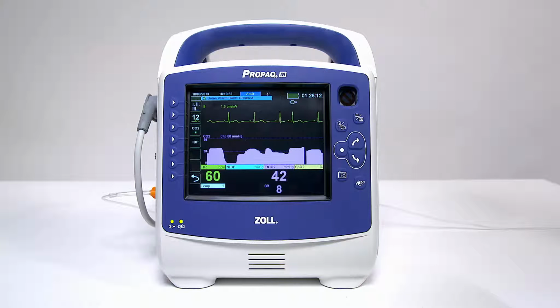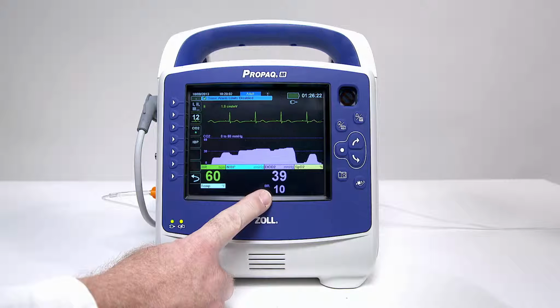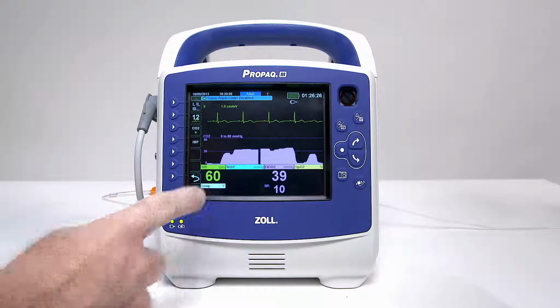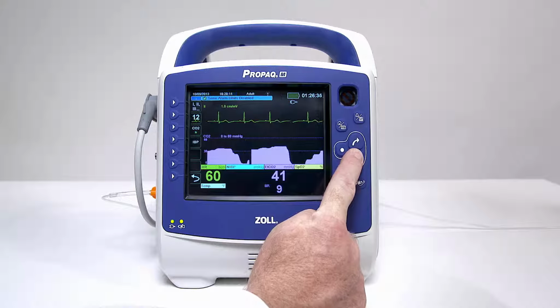The CO2 display gives the current EtCO2 value, the concentration of carbon dioxide detected at the end of each exhalation, after a delay of approximately 1 minute. It also shows the patient's respiration rate in breaths per minute, identified as BR. The capnogram waveform is inserted automatically in the waveform display window.